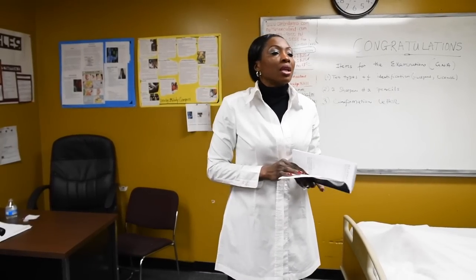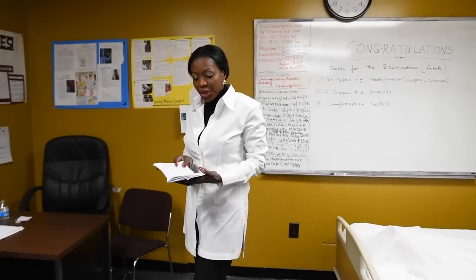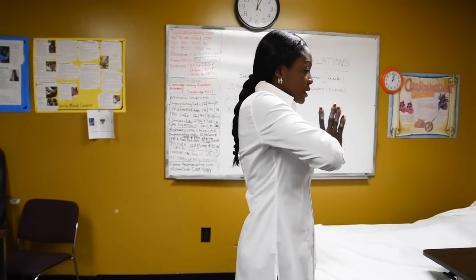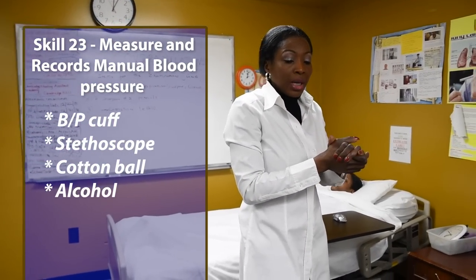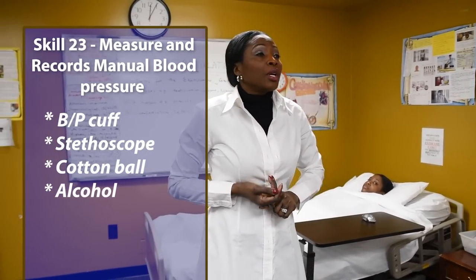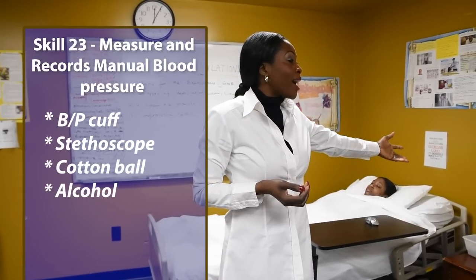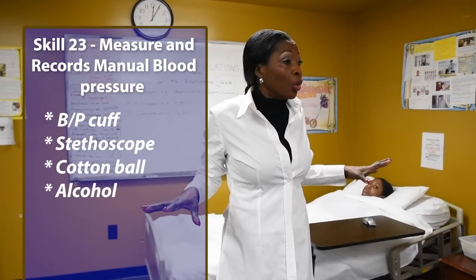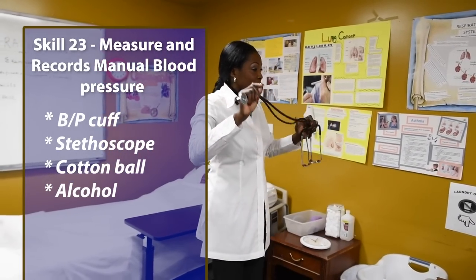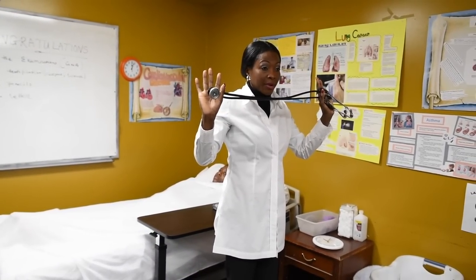The last skill concerning a human being that I'll be demonstrating for you is blood pressure, okay? So go to page 38. Blood pressure is also part of our recording skill. Write this down, the equipment you need in order to perform this skill for the examiner. You're going to need a blood pressure cuff. You're going to need a stethoscope, which will be provided for you, so you don't have to bring your own, because you are using the examiner's double lumen stethoscope the day of the GNA exam, all right?